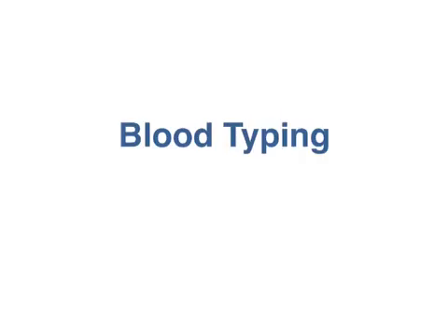In this video, we'll be discussing the concepts behind a very important procedure, blood typing. Oftentimes, patients need a blood transfusion because they've either lost blood due to an accident or normal blood loss during surgery. It's not uncommon for patients to need a blood transfusion because of surgery. And if the blood is not properly matched, the patient may suffer what's known as a transfusion reaction. In an acute transfusion reaction, the donor red blood cells end up completely lysed, just burst into pieces.